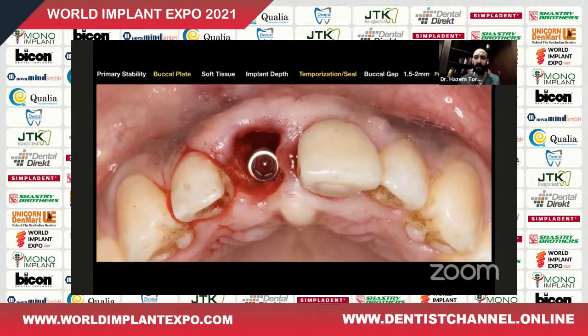The soft tissue thickness. What do we need to do in order to treat a patient, let's say an immediate upper central, immediate implant placement that has thin tissue biotype? Do we need to thicken that tissue biotype, or how do we change our workflow, or how do we adapt our workflow for the patient and for this situation?